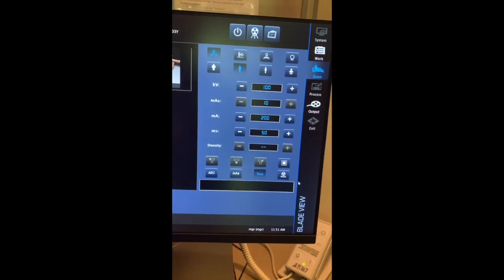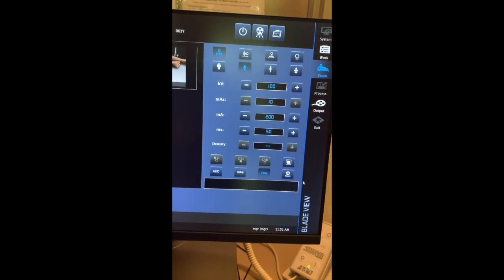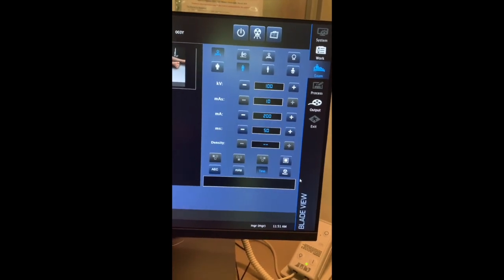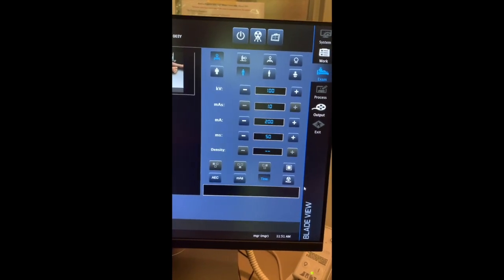You'll see on the back of the page it has for each group what their kVp is. And I'll assign you guys the numbers after we do the lab. So we're gonna do group 1, that's set up how it was. And it's 100 kVp, 10 mAs, a 200 mA station, and a large focal spot.